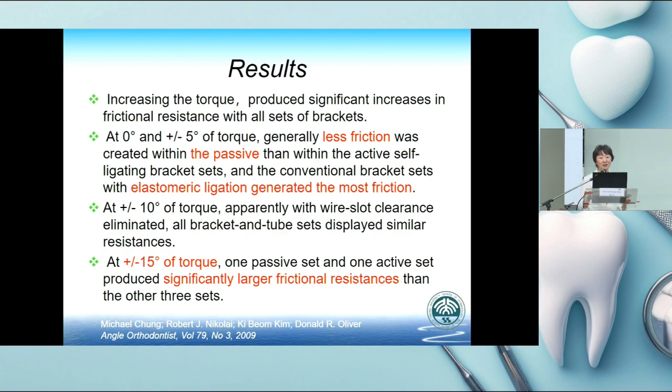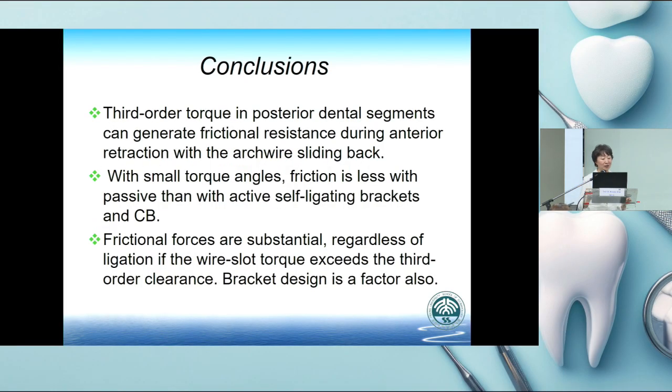We had better not have torque when we want to slide. Zero torque has less friction. But if we do need to give some torque, don't give high torque. Maybe torque within 10 degrees is better. You can have the torque expression you need, and you don't have very high friction.